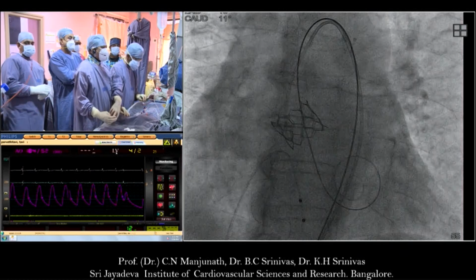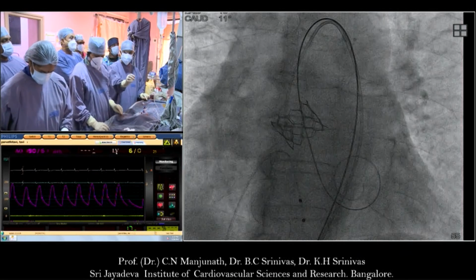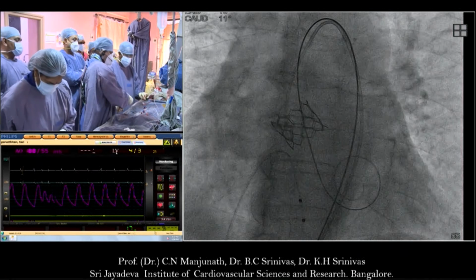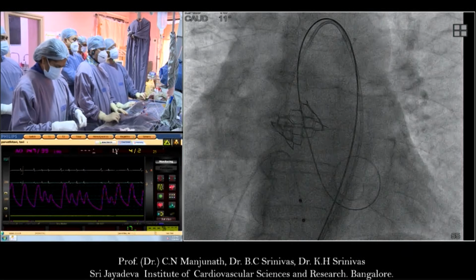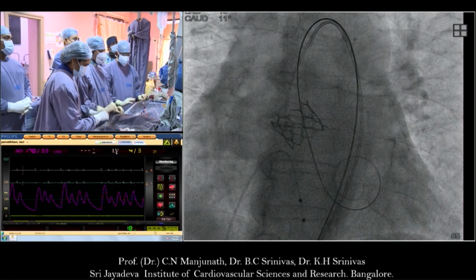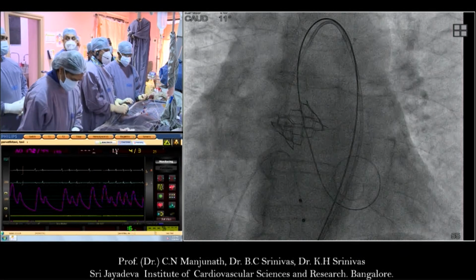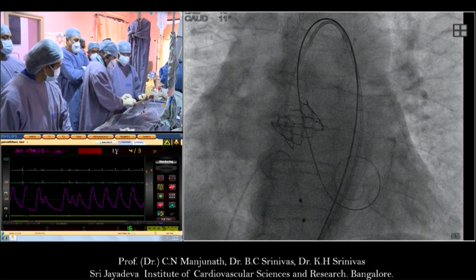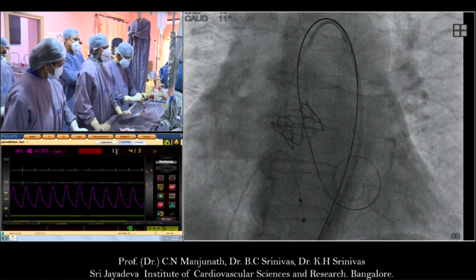It all depends on what you are doing frequently. Interventional cardiologists, we are comfortable with stenting. That's how we take it and deploy it. But each of them has its own advantages and disadvantages. For the 34 type of huge, big annulus, you could do it with a self-expandable valve, unlike over-expanding the Edwards, where you can take a few more cc and do it. That's why I keep telling, depending upon the patient, we need to select the valve rather than having a blanket statement that I'll do only this or the other type of valve.